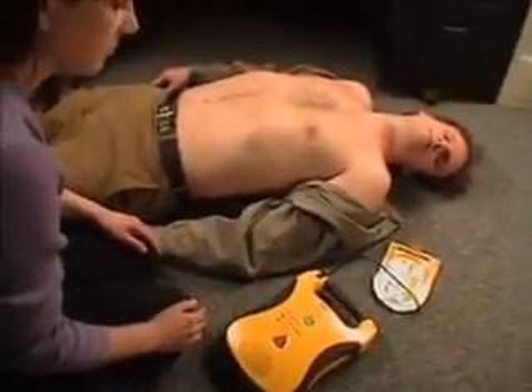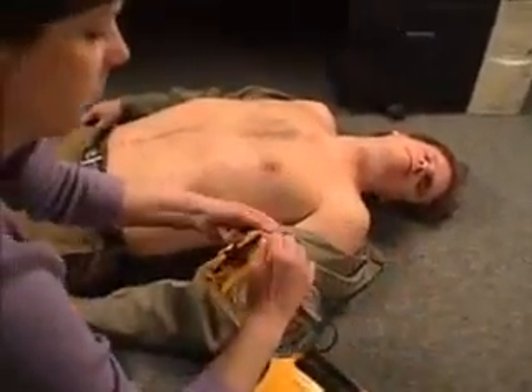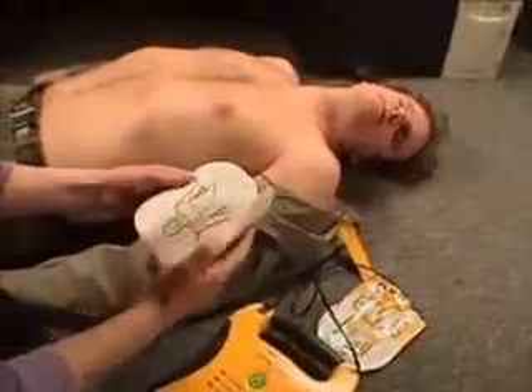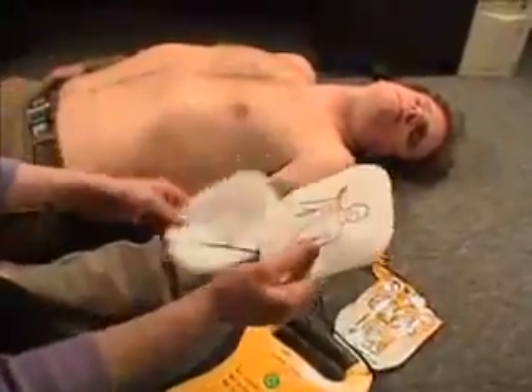Call for help. Apply pads to the patient's bare chest as shown. The Lifeline AED is designed to be so simple to use that virtually anyone can save a life.